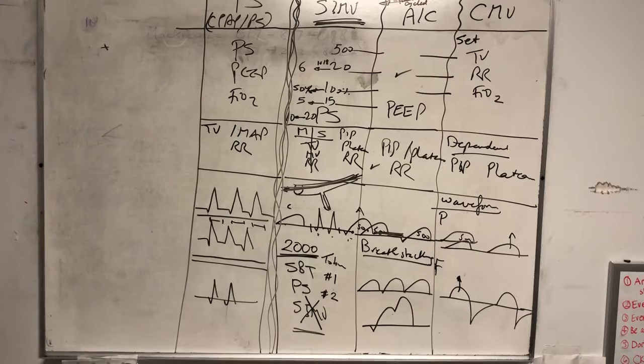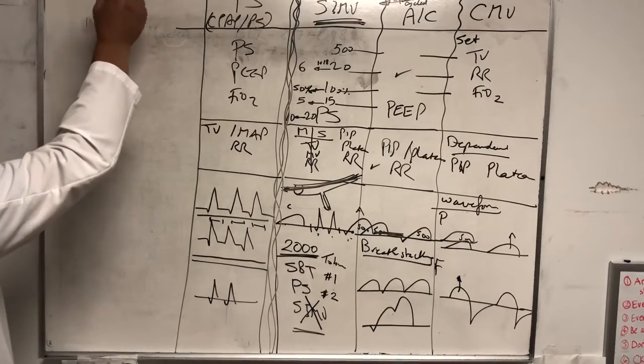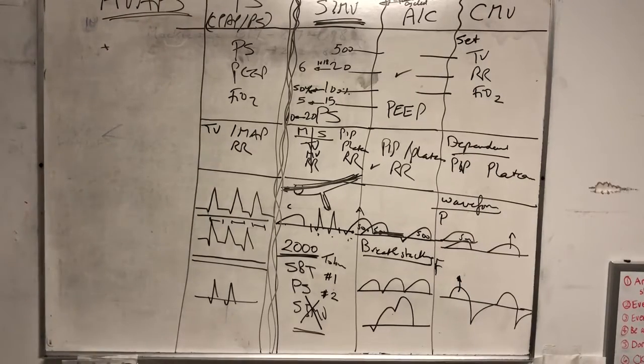This mode of ventilation is gonna come back, and probably is coming back as we speak, as a strong mode of ventilation that may actually take over, or at least partially take over, the volume control that everybody likes. It's gonna come back in a mode of ventilation called AVAPS. And AVAPS is one of the advanced modes of ventilation. So when we talk 3 obsolete, 3 current, and 3 advanced. I'm just cheating. I'm going to the last lecture of the vent, which is the advanced modes of ventilation. But it's the same thing as pressure support, and that's how pressure support is probably gonna come back.